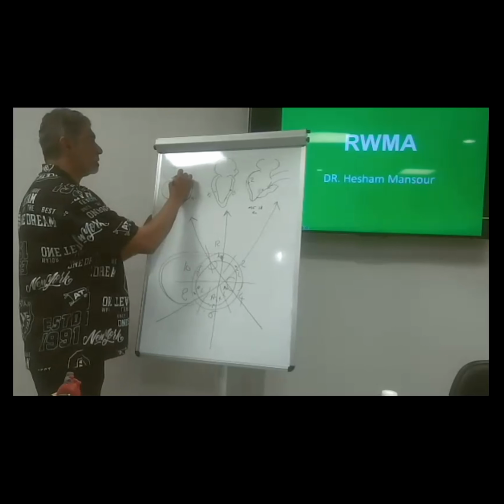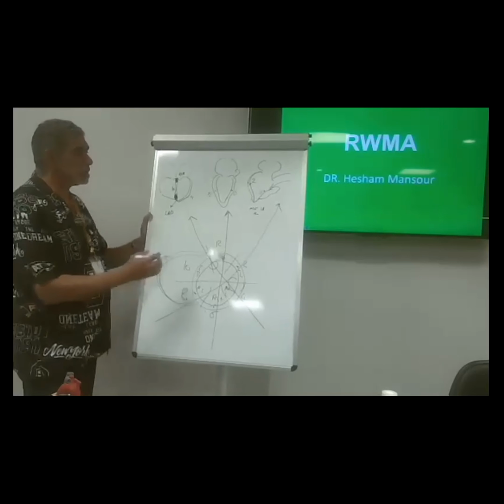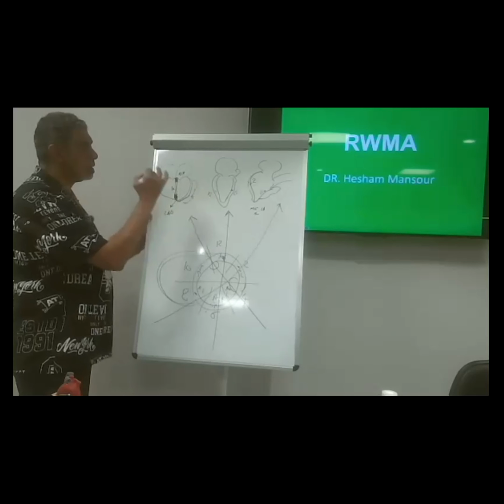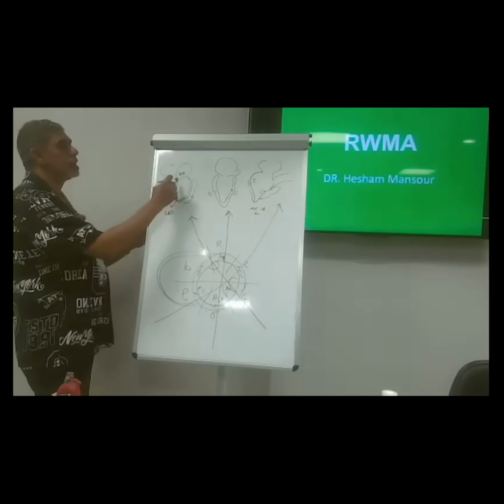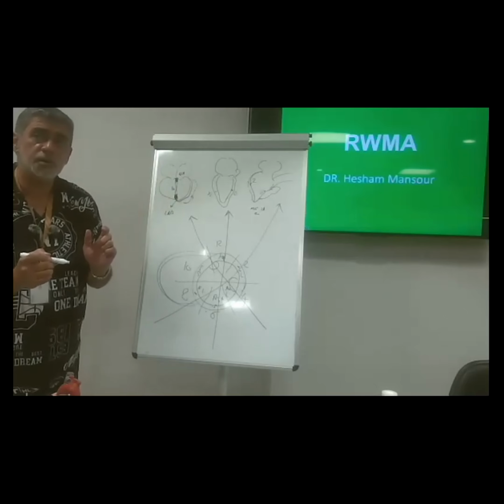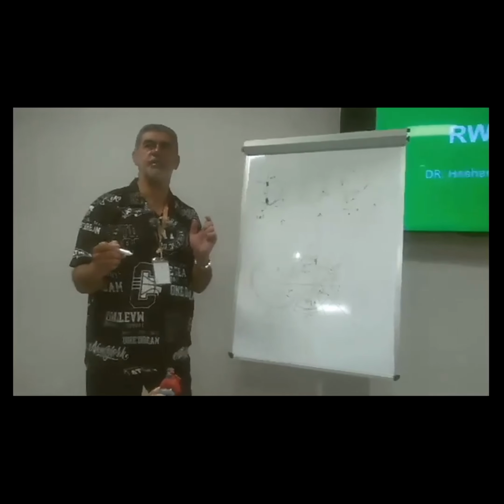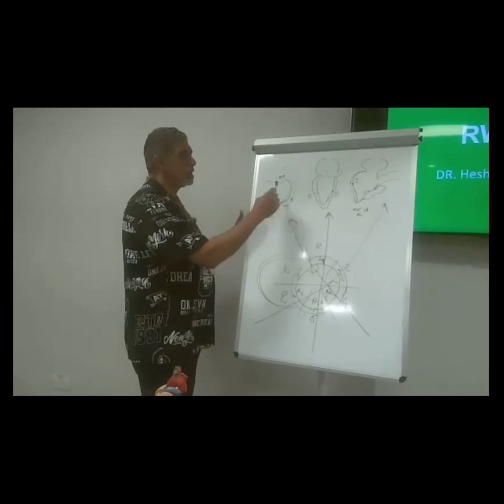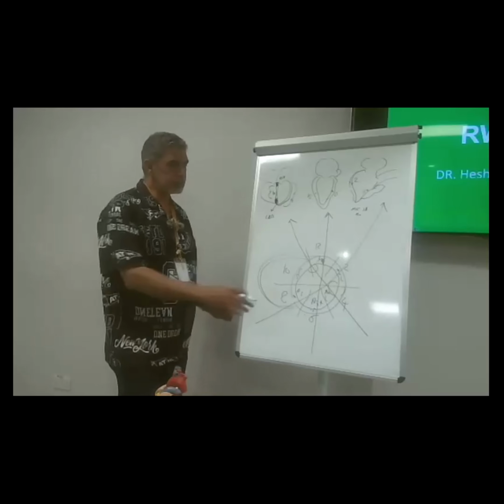Bravo. But here we have a mix. This also is a mix. Let's go to this one.